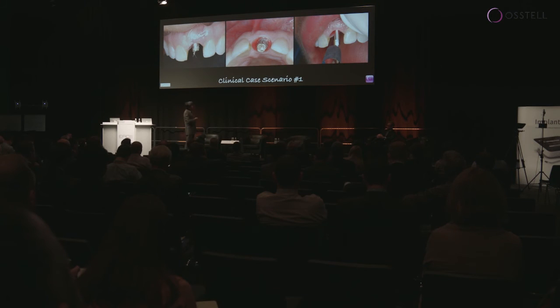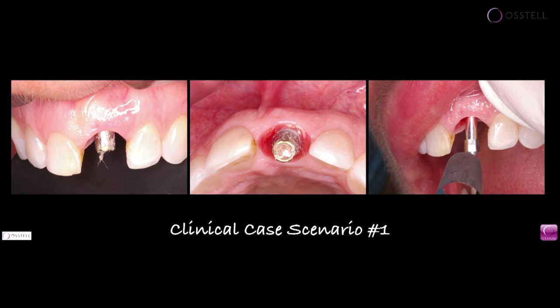Now, at 6 months, we remove that crown, and you can see, again, the maturation of the soft tissue. We have a little bit of cement exuding out from underneath that crown. So this is the real main reason why I prefer to go with a screw retain provisional restoration rather than cement retain. But you can obviously see the health of the tissue as well as the papilla maintenance around those natural teeth. And now at 6 months, the ISQ value is 84.